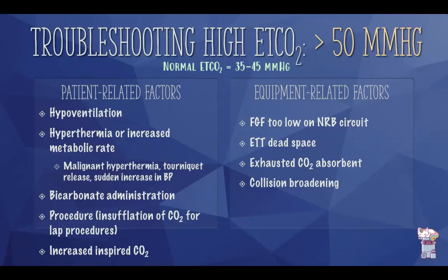Anything that increases your metabolic rate, such as hyperthermia, will also increase your end-tidal CO2 reading. Malignant hyperthermia is one of the more common reasons that end-tidal CO2 suddenly increases while a patient is under inhalant anesthesia. Administration of bicarbonate will be converted to carbon dioxide within the body and thus increase your end-tidal CO2 reading. Insufflation of body cavities with carbon dioxide for laparoscopic procedures can also increase your end-tidal carbon dioxide reading. An increase in inspired concentration of carbon dioxide will also increase this reading.